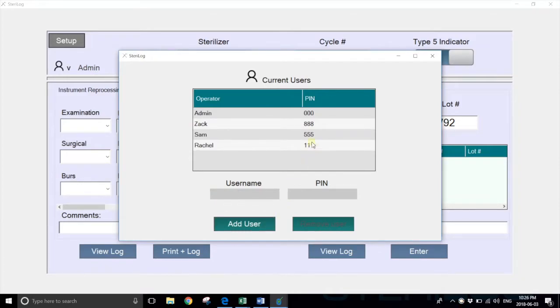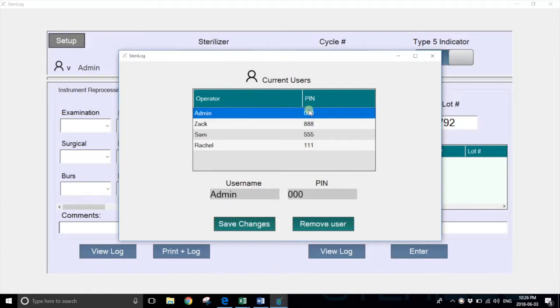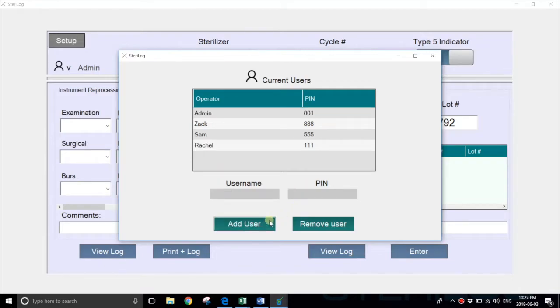To modify a PIN, we can select it from the rows here. For example, admin—we can just change the PIN and hit save changes.